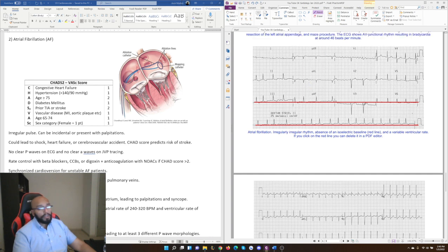This ECG is showing you atrial fibrillation. You have an irregular rhythm. So there is irregularity. You can see these two only have 2 boxes in between, these have 3, these have 3, and then if you look at the longer version, which helps to see it even better, you can see there's no pattern in between the lines I drew. Is it medium, small, medium, long, medium, small, medium, small, medium, small, small, medium. Very, very irregular, no pattern.